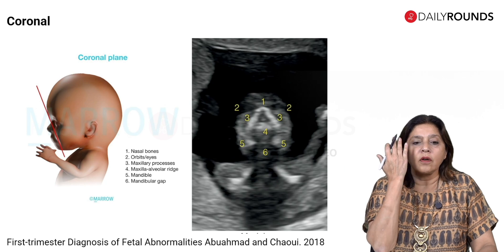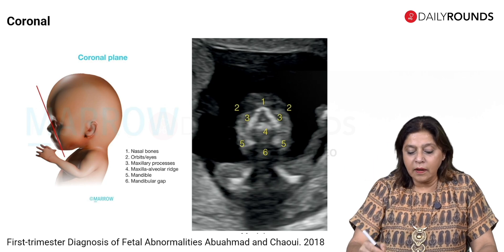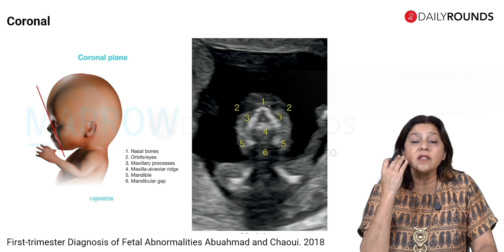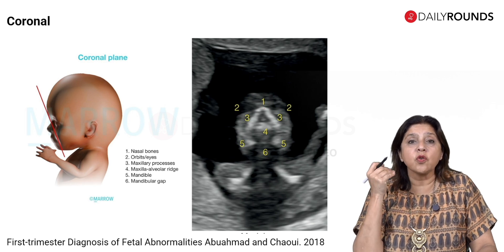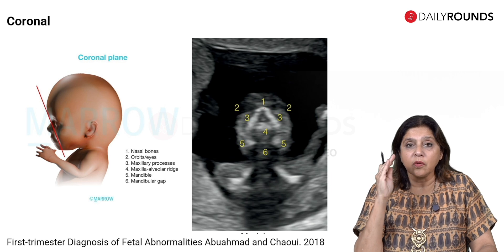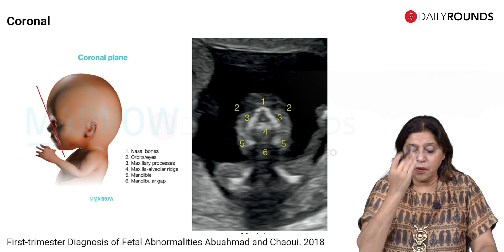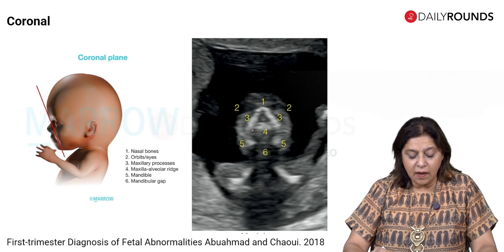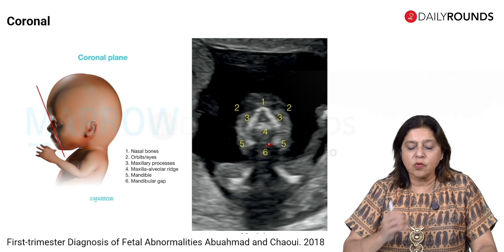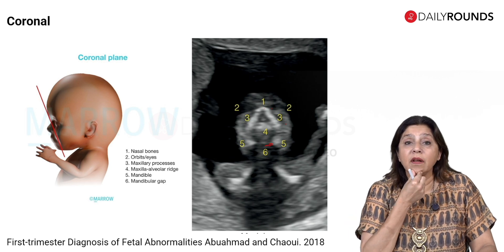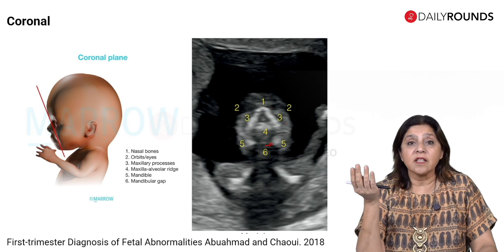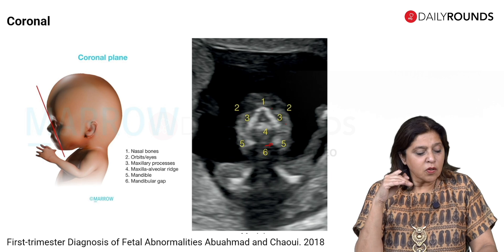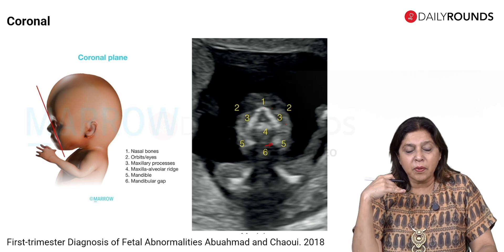Moving to the coronal plane, you try to see the two nasal bones. This is useful when you're unsure whether you're seeing an absent nasal bone — bring the probe to view from the front and see the two nasal bones on top of the two maxillary processes. You also see the alveolar ridge and the mandibular gap, which is important — if the gap is not there, there is a higher chance of micrognathia.